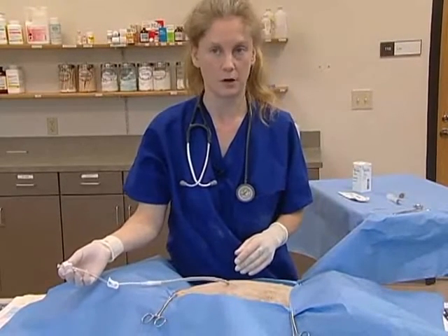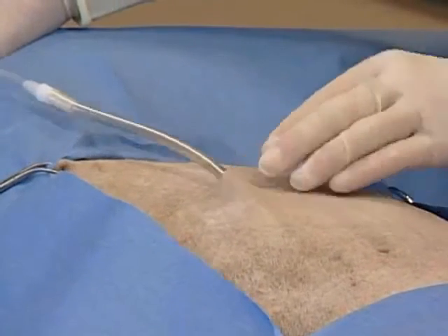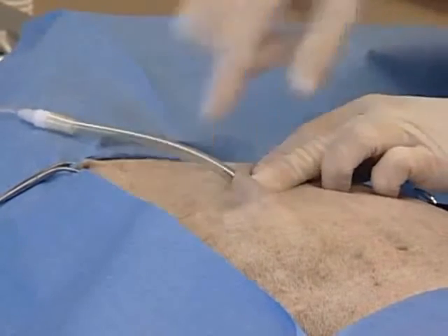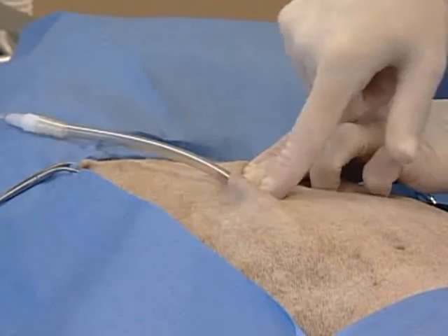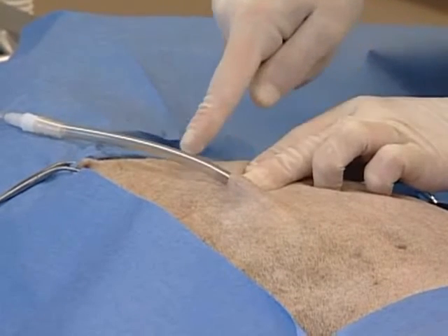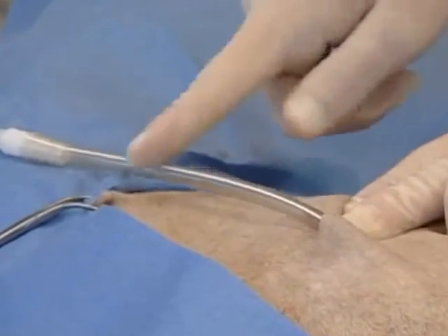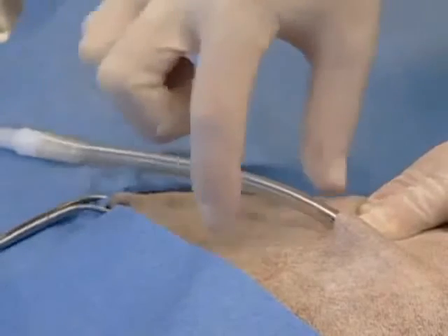In order to secure the tube, take some suture and make a circumferential suture around the chest tube just above the point of insertion, then attach the chest tube either via a Chinese finger trap tie, or some people will place two butterflies of tape and secure those in two separate locations to the lateral chest wall.